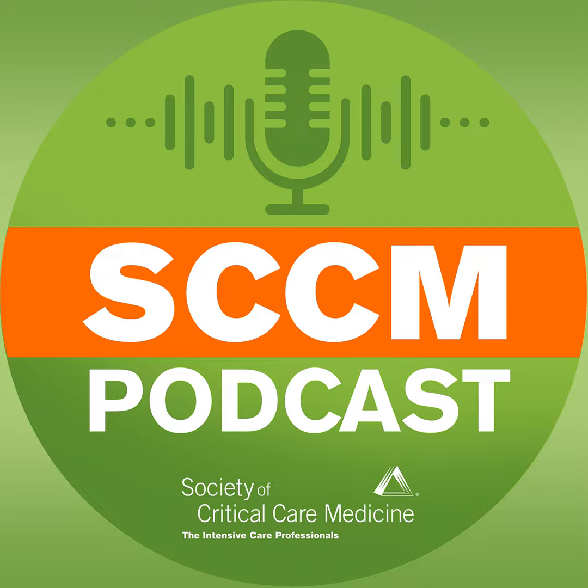Very interesting. Thanks. So you mentioned monitoring. How would you troubleshoot alarms with this system for those of us that are not engineers? Well, one of the issues with using this is you can't use too many of the alarms on the ventilator. You can use one alarm, which we did, and that is if you looked at the exhaled volume, you could set the exhaled volume in the ventilator to be equal to the sum of the exhaled volumes of the two.